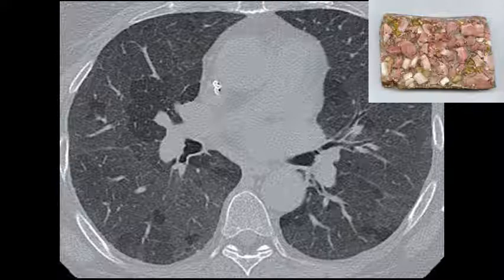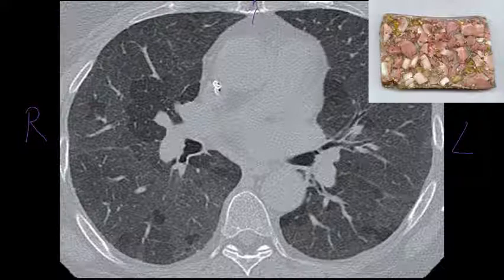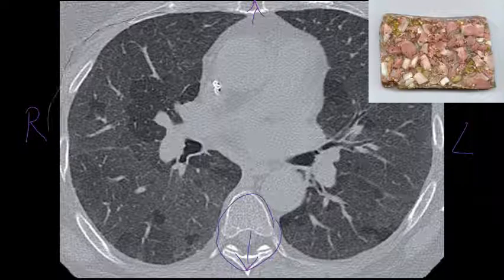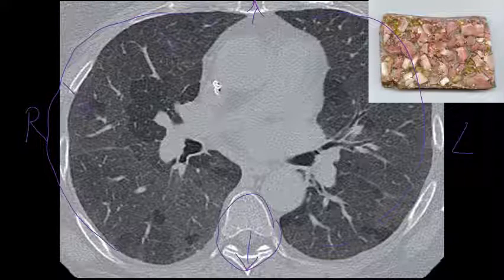On a high-resolution CT scan, this image is cut transversely — left and right sides of the body, front and back, with the vertebral column visible. The right and left lungs are shown here. In the areas marked in purple, the lung has increased attenuation — it's whiter than it should normally be. Normal lung appears black on CT. These white areas are called ground glass opacities, because they look like ground glass as seen in a church window. They are bilateral, and bilateral ground glass opacities are a key finding in hypersensitivity pneumonitis.